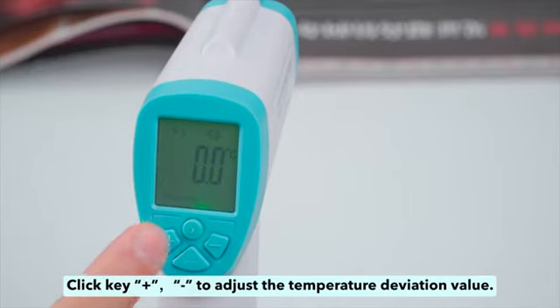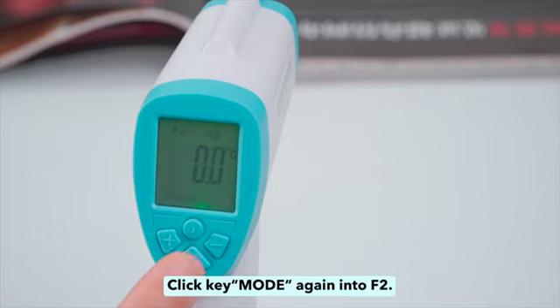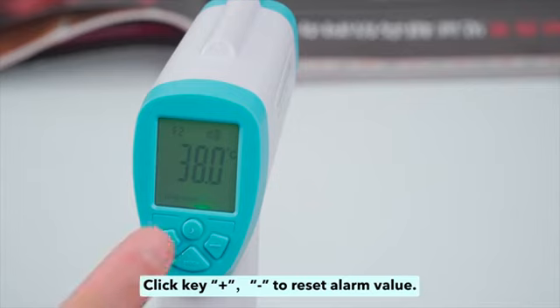Click plus or minus to adjust the temperature deviation value. Click key mode again to enter F2.